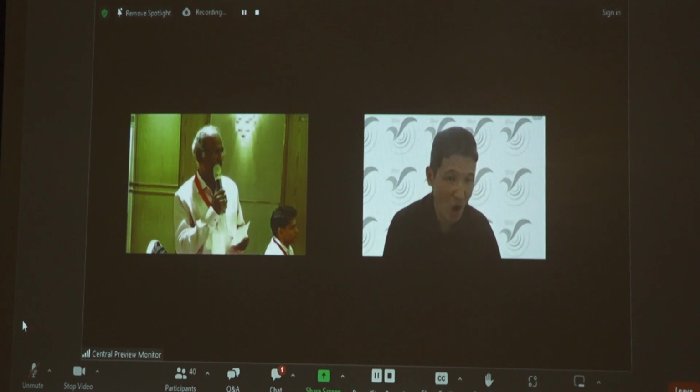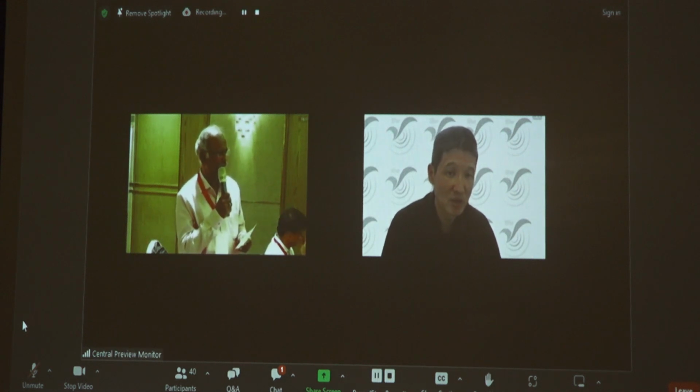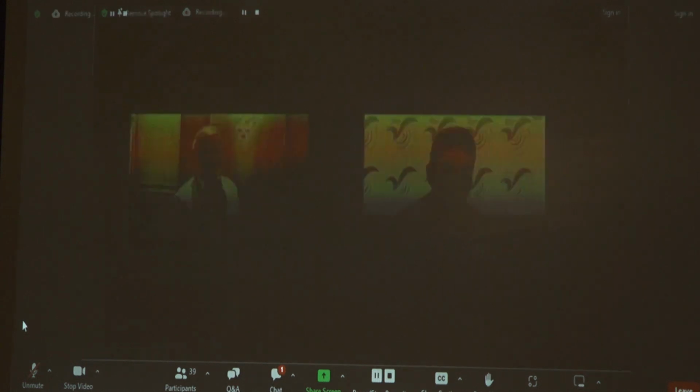So you can always undo it after you insert the nail. If you have negative reduction, you could undo it and get the proximal fragment back into the positive reduction place. And then I keep my K-wires in that position, and then I try shooting my guide wires for the blades or the screws.